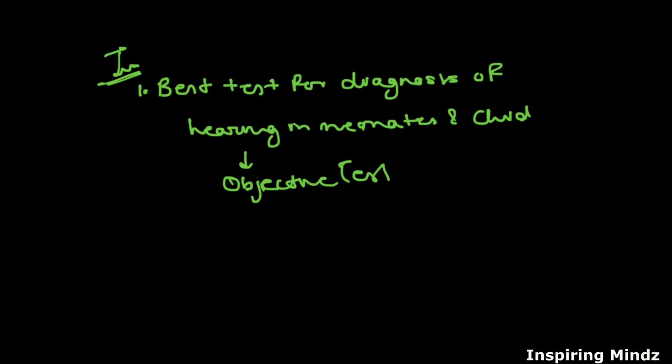By objective, I mean that here you do not require the response of the child. Second, it is the best diagnostic test for malingering.